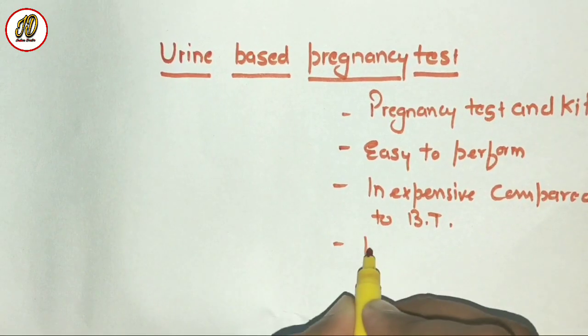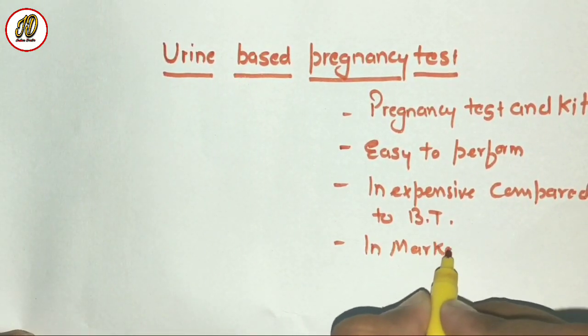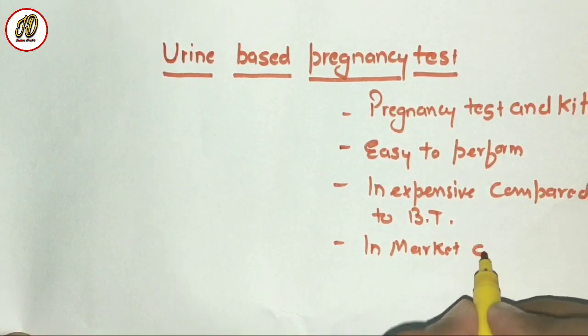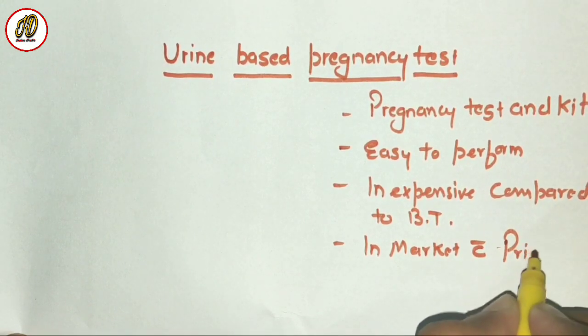And in the market, the urine-based pregnancy test kits are available without any prescription.